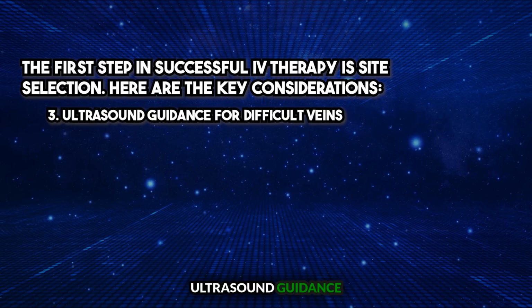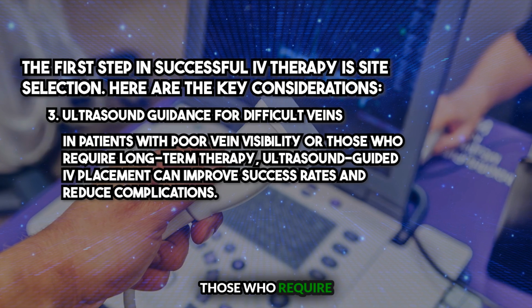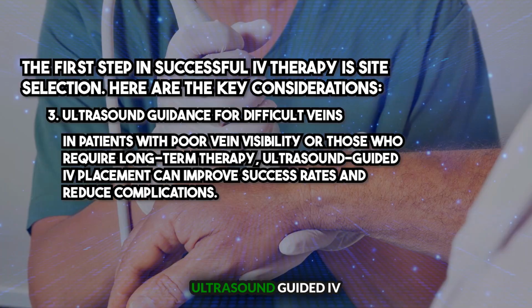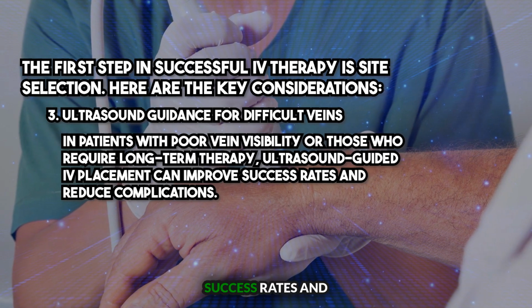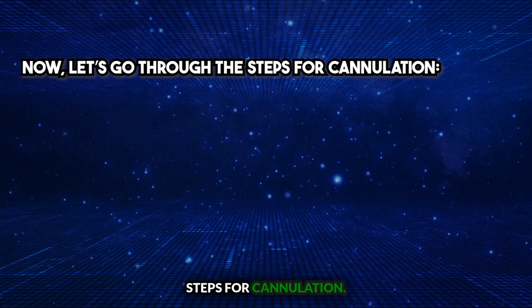3. Ultrasound guidance for difficult veins. In patients with poor vein visibility or those who require long-term therapy, ultrasound-guided IV placement can improve success rates and reduce complications. Now let's go through the steps for cannulation.